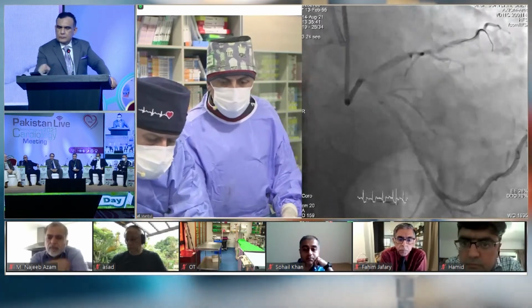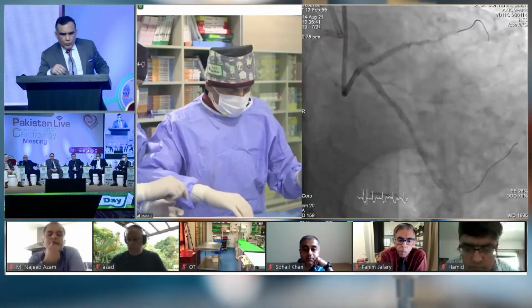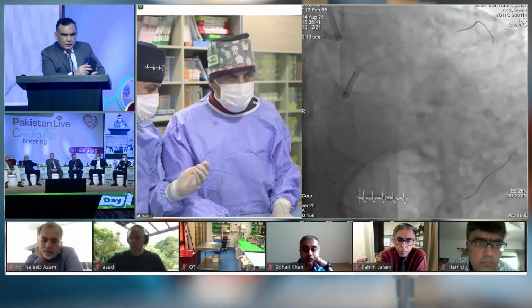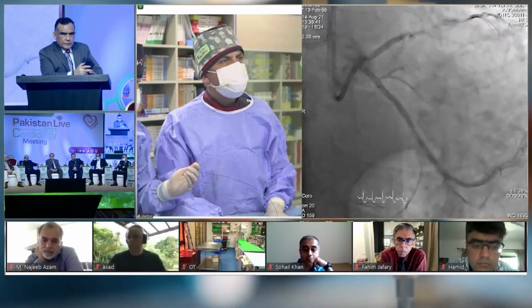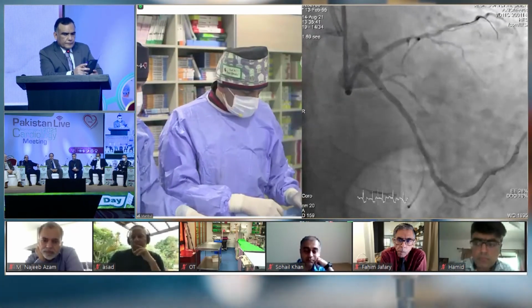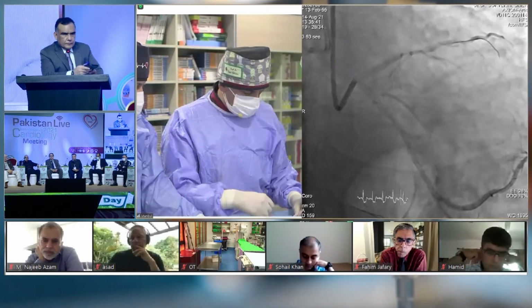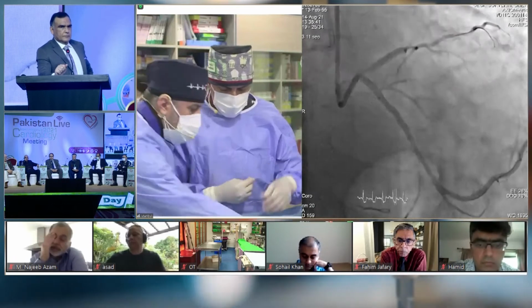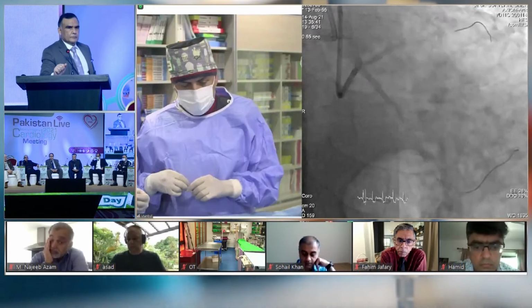Can I? So what wire do you have at the moment in the LAD? In the diagonal I have a BMW, which is a workhorse, yes. Now I'll insert IVUS just to show you the proximal cap.